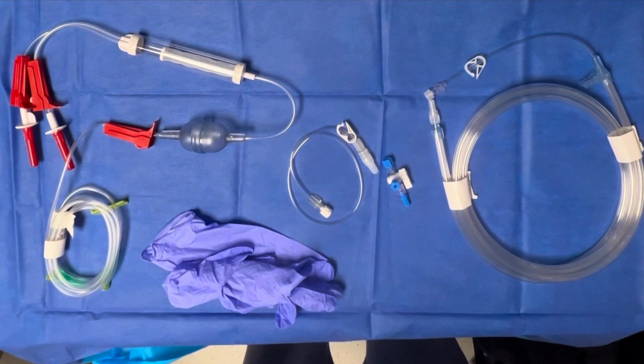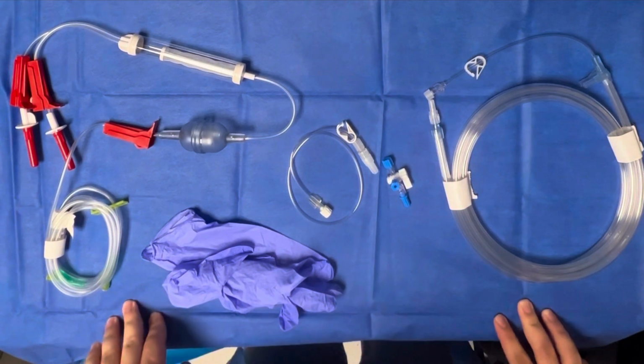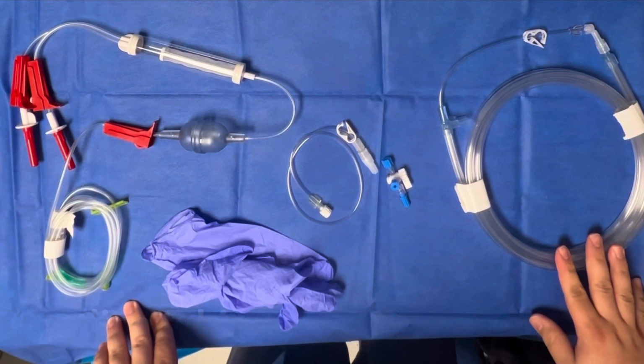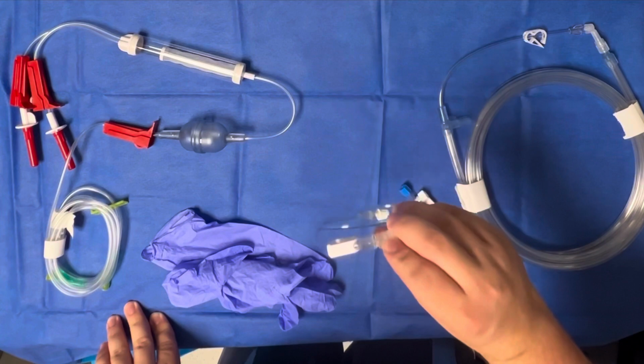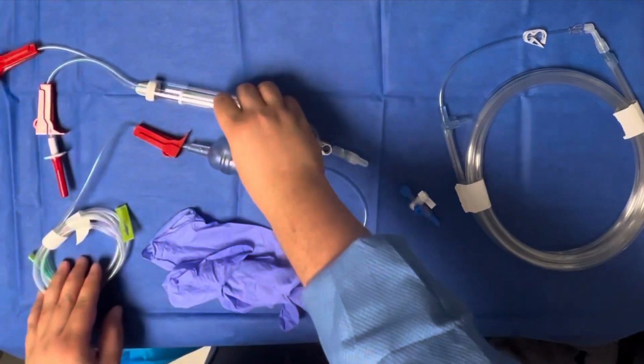Okay, so today we're going to be making dry lines for your hotline. So first we're going to have to gather all our supplies together. We have our coiled tubing here. We have our stopcock. We have our extension. And then we have our Y tubing, our blood tubing.